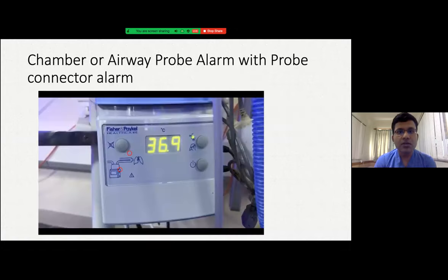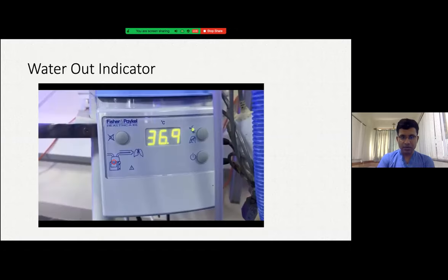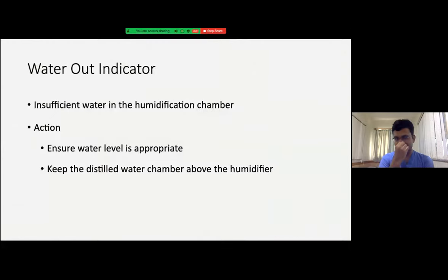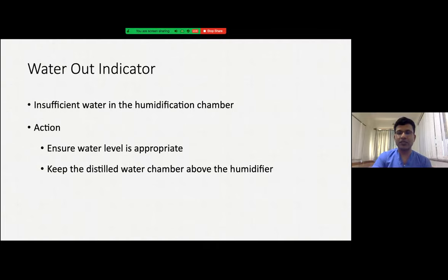The chamber probe can also activate with a probe connector alarm when the temperature probes are faulty — again, they must be replaced. The humidifier base alarm can occur because of insufficient water, which can result in dangerously high temperatures. Ensure the water level is appropriate. Also ensure, as shown in the demonstration, that the distilled water chamber is always positioned above the level of the humidifier — not below — so that the autofilling function works properly.